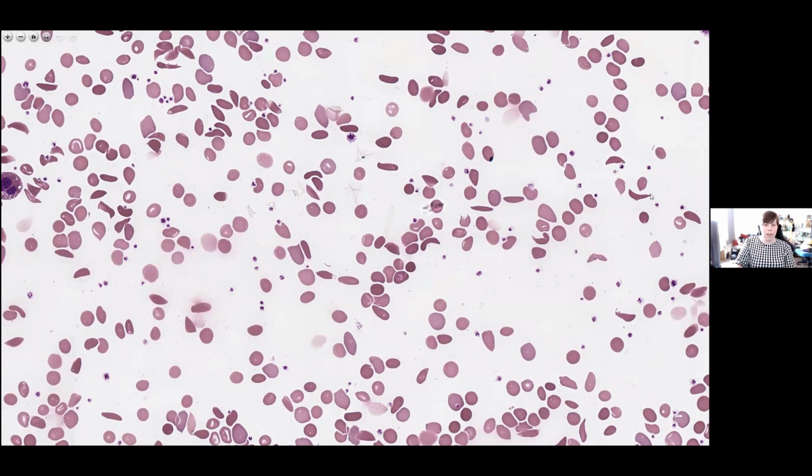They are very elongated and pointy, very sharp looking cells, which are the pathognomonic cell of sickle type disorders. So patients who have sickle cell disease, and combined inheritance of sickle cell with some other thalassemias and hemoglobinopathies or hemoglobin variants, can have the appearance of these cells, which occur during low oxygen tension. Now, these cells are very problematic for the patient. They can irreversibly polymerize into this shape, and they get stuck in the microvasculature of patients' blood vessels.